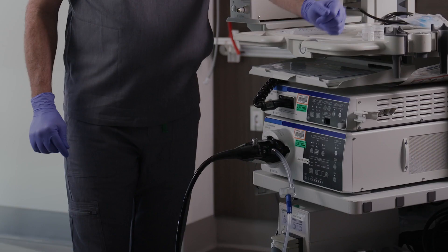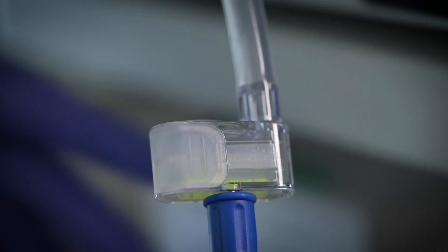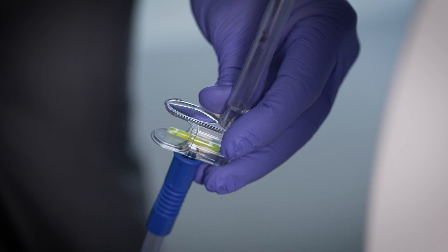Once you validate that the specimen is retrieved through the magnification window and the illumination, you can take one tray out, take one of your additional trays, reinsert it, and continue working.